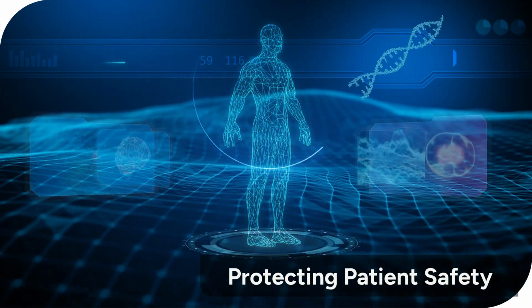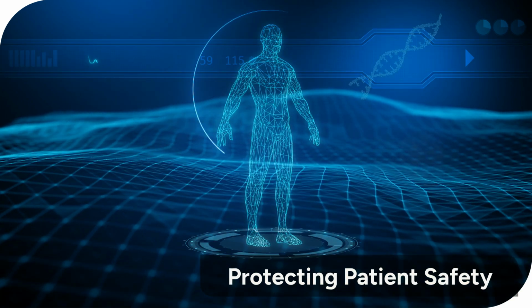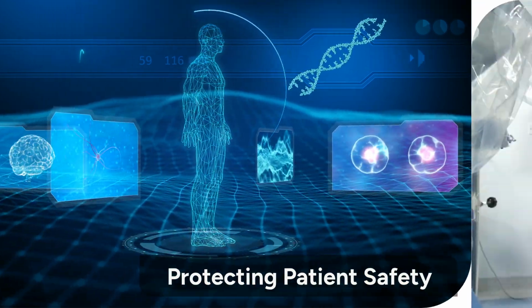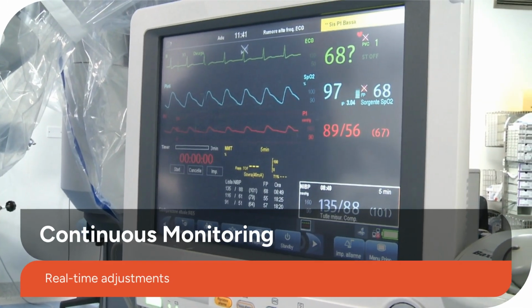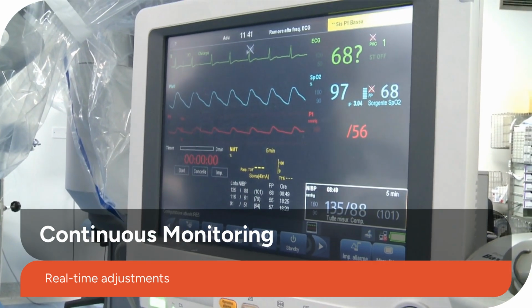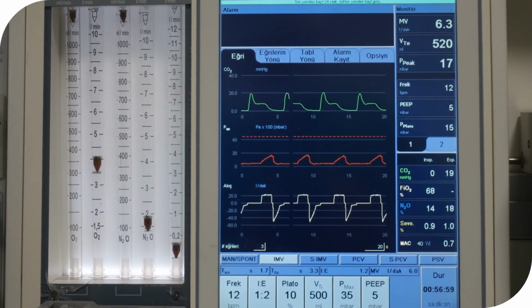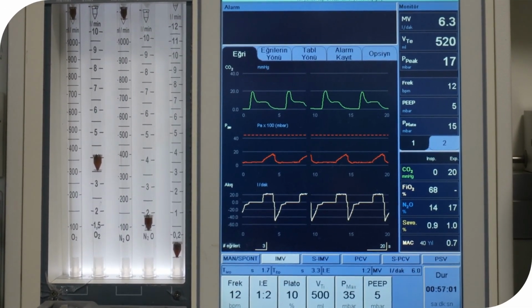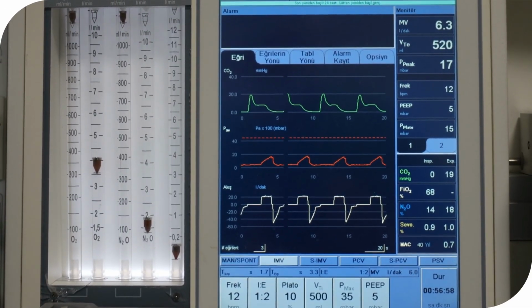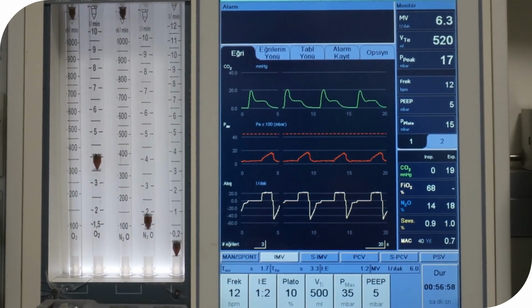Anesthesia awareness monitoring is a critical tool that adds an extra layer of safety, offering objective data about the patient's true state of consciousness. Monitoring is continuous throughout the entire procedure, allowing the anesthesiologist to quickly respond to any changes in the patient's brain activity. These modern safety standards in anesthesiology rely heavily on technology like processed EEG indices to ensure a safe, comfortable, and successful surgical experience for every patient.